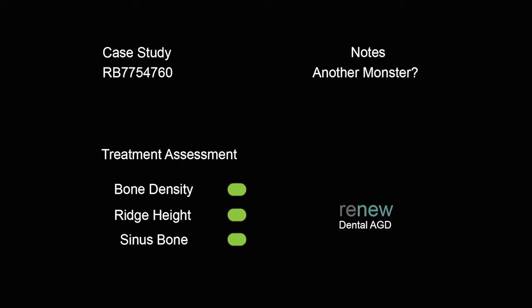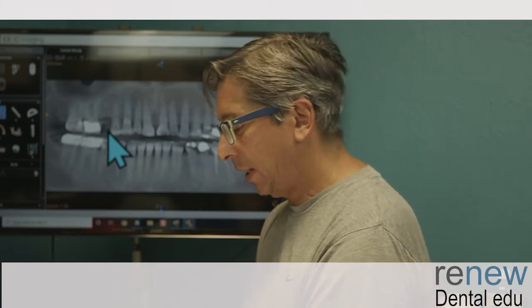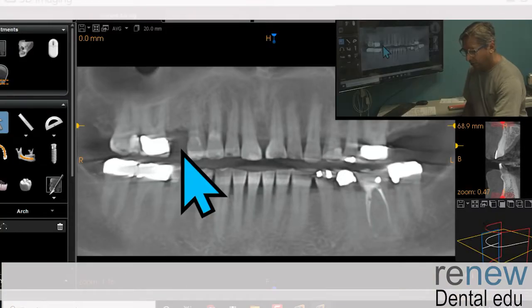So now, in our treatment assessment, he's pretty much green when it comes to bone quality and facial bone constriction and sinus bone, of course, and all these things. Those are all greens and light greens. But where he comes down with the oranges, he comes down with a repeatable bite, chew pattern, and failing front teeth. So those are the areas that are really the concerns here, not the quality of bone. The bone quality is amazing, so we'll take a look at that in just a second.